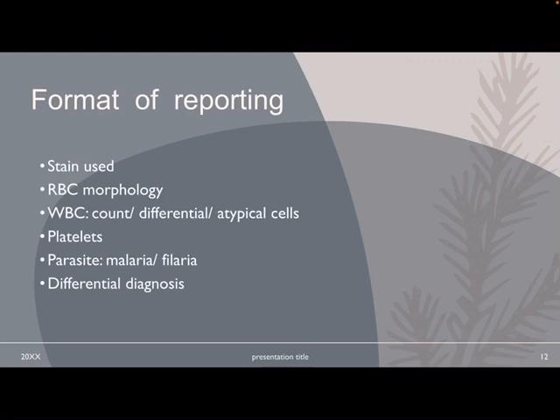For hemat cases, you can write acute leukemia and then advise flow cytometry, because you are not supposed to give acute myeloid leukemia or acute lymphoblastic leukemia, especially during slides. That is what our teachers have said, and in practice also you give like that, mainly because the morphology is very deceptive.